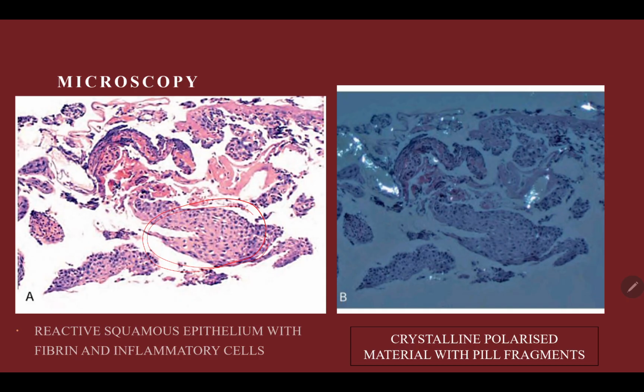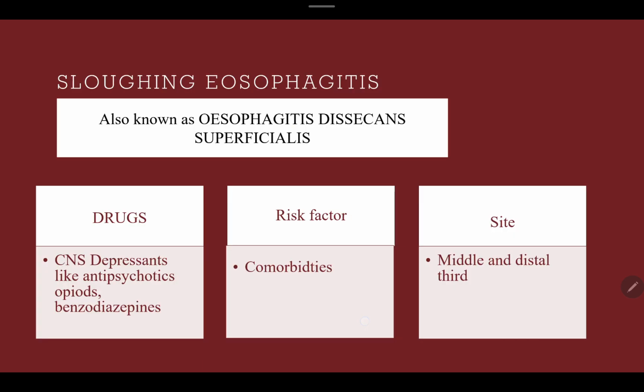When we look under a polarized microscope, we can see pill fragments highlighted by the polarized microscope.